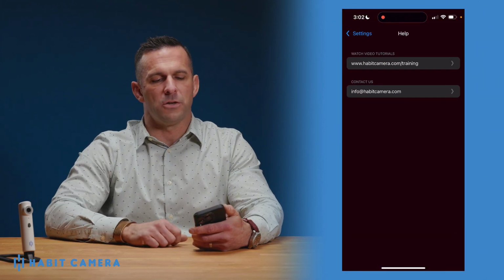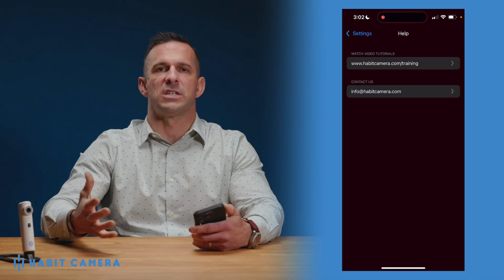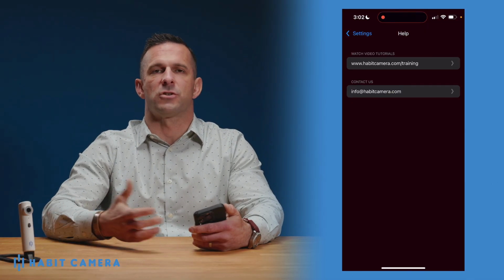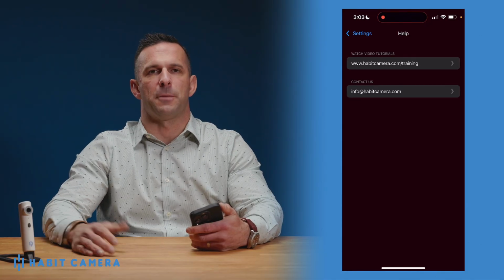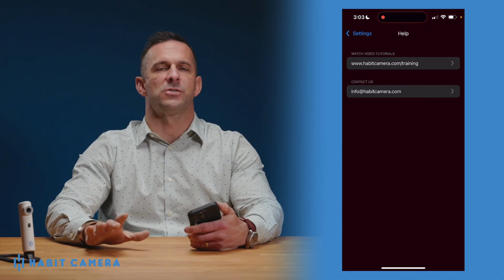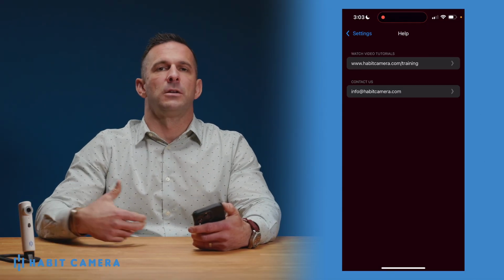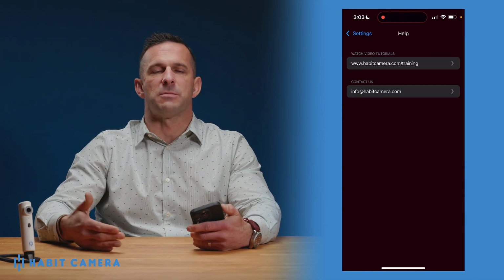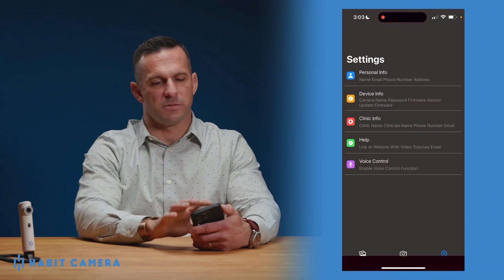The help menu has links. One link is to our website where we host these videos and instructions manuals. And the other link is to support, which is info@habitcamera.com. And so if you ever have any issues with using your device or the functionality or troubleshooting needs, the way to contact us, please email us at info@habitcamera.com and we'll get back to you as quickly as possible.